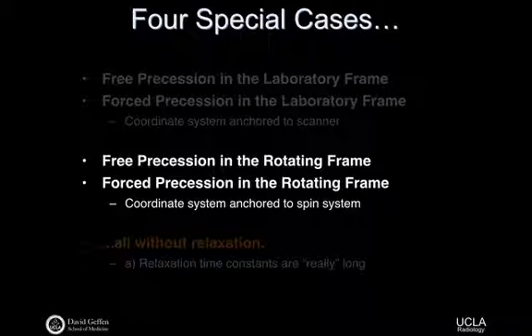I think it's more intuitive to think you have a fictitious inertial B field that cancels out the original field. Yep, that's exactly right. This term here, what I sometimes have been calling the fictitious field, just cancels out this term here, because you have a non-inertial frame. Actually, I wouldn't say inertial frame, but you have a rotating frame.